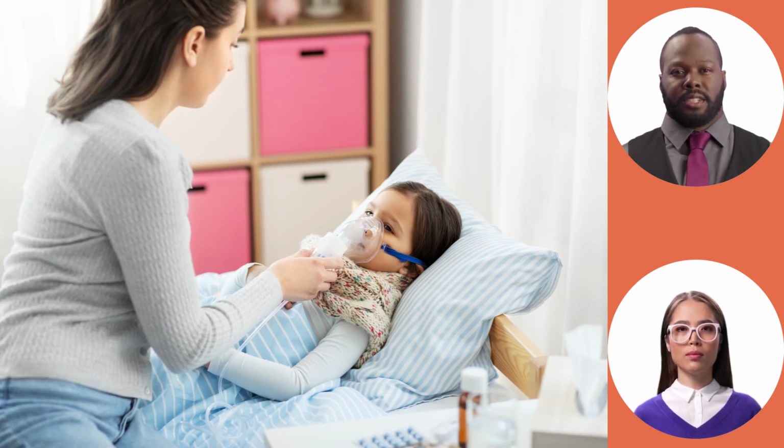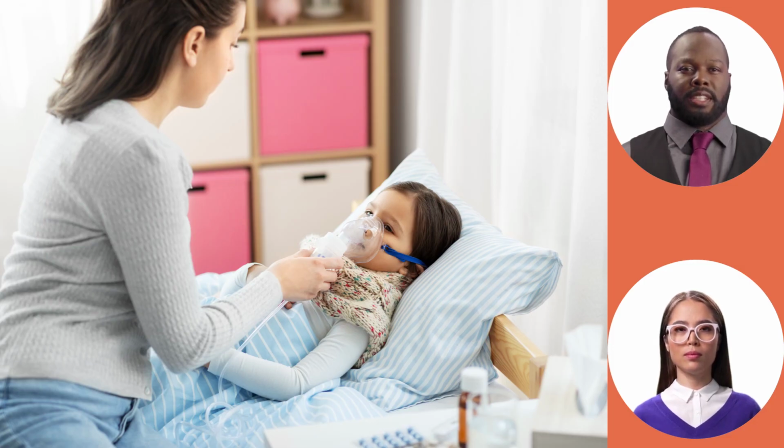As medical assistants, you'll often need to teach patients how to use a nebulizer at home. Keep these tips in mind. Use clear, simple language and visuals when explaining the steps. Demonstrate proper assembly and use. Emphasize the importance of cleaning the nebulizer after each use. Encourage patients to ask questions and address any concerns.